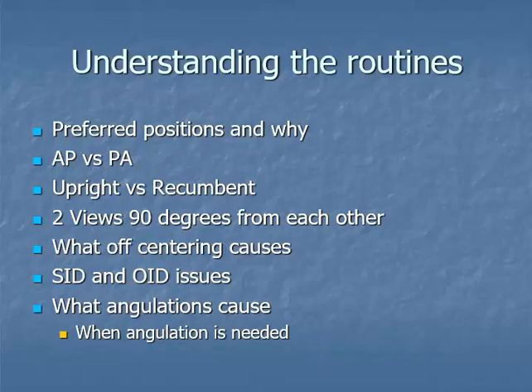So the question then becomes, if you're taking an x-ray on a pediatric patient, what would be the easier way to get cooperation from that patient to shoot the image, AP or PA? Well, probably AP, instead of cramming the image receptor directly into the patient's face and scaring them half to death. If they're, say, a 2-year-old child, just turn them around on the table and shoot them AP as opposed to shooting PA. So things like that.